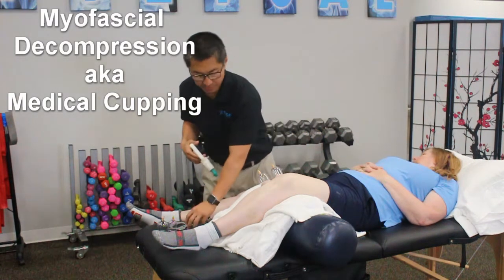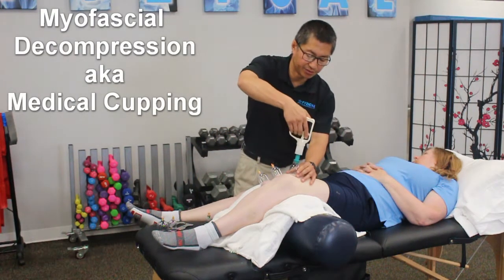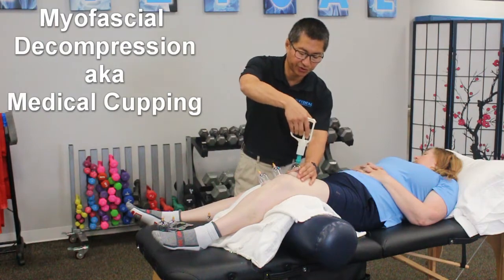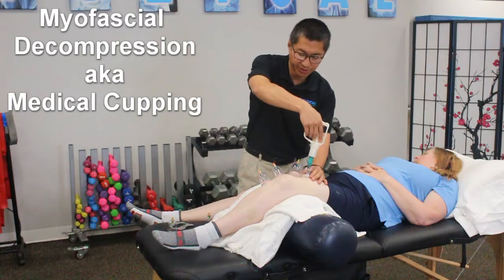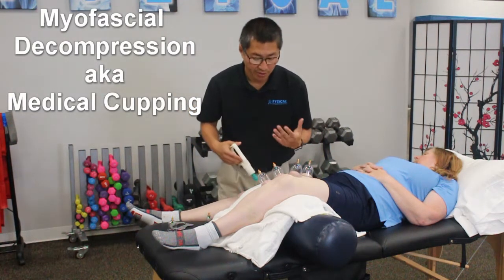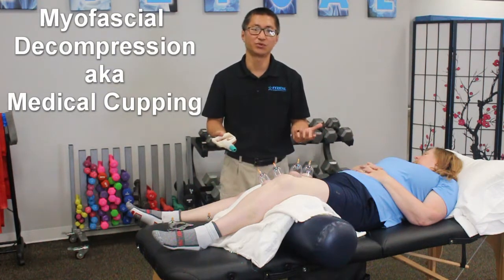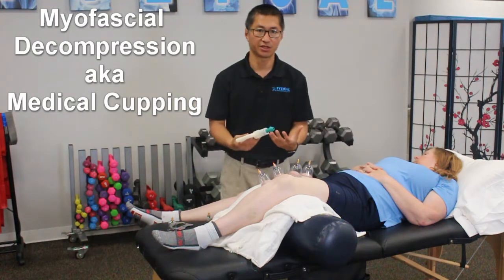And we're also going to pop some along the quadricep muscle where she potentially has a little bit of a sprain or a strain right there through the quadricep tendon. So with, like I say, an acute injury, we're not going to get too aggressive with it, just nice light decompression of the area. And I'm going to leave this on for about a minute or two, just to encourage the tissues to decompress themselves, get the circulation flowing.